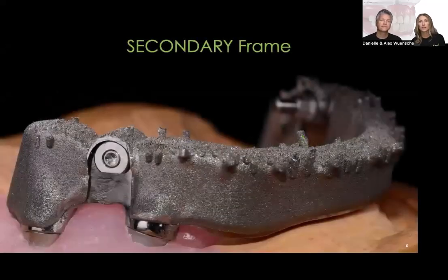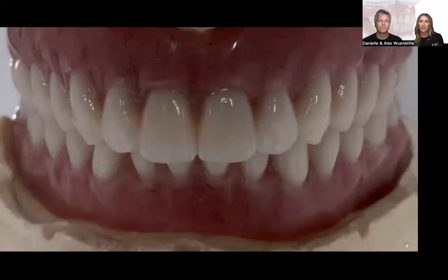So here we have the secondary frame that also shows the plungers on each side, and here, I think it's not processed yet, right? No, it's not processed just yet, to fit over. And then here we have a final restoration.